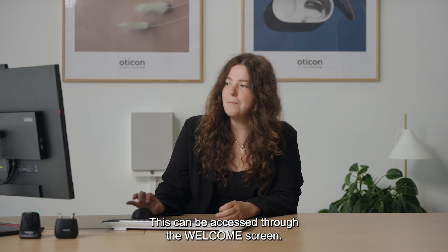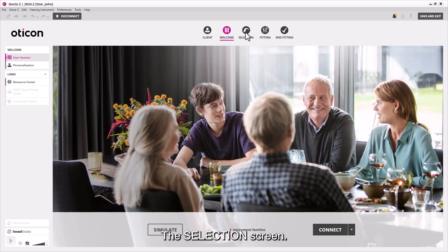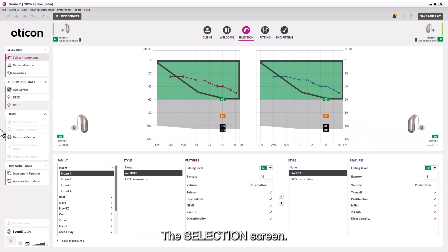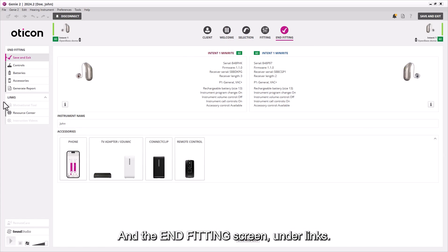This can be accessed through the Welcome screen, the Selection screen, and the End Fitting screen under Links.